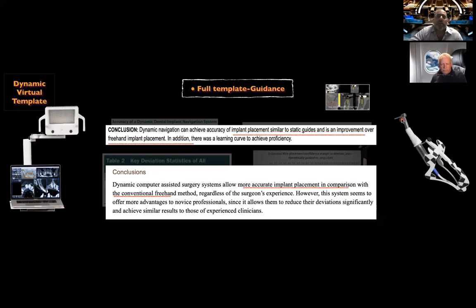So if we can have something that's as good as a static guide, and I believe once you get really good at this, you can be even superior to static guides, because it's kind of like playing a video game. The more you play it, the better you get. It's basically that simple. You just have to keep moving along and not just let it sit in the corner. Use it, use it, and use it some more, and you will get better.